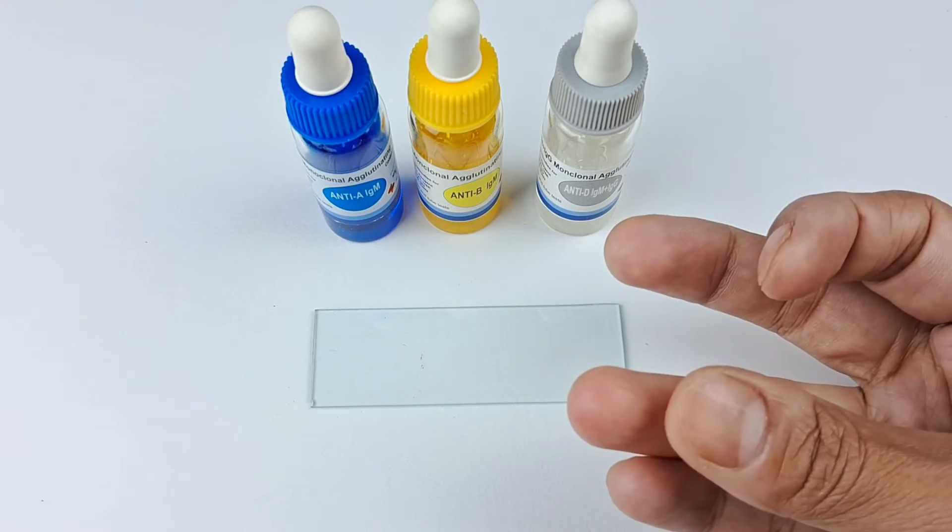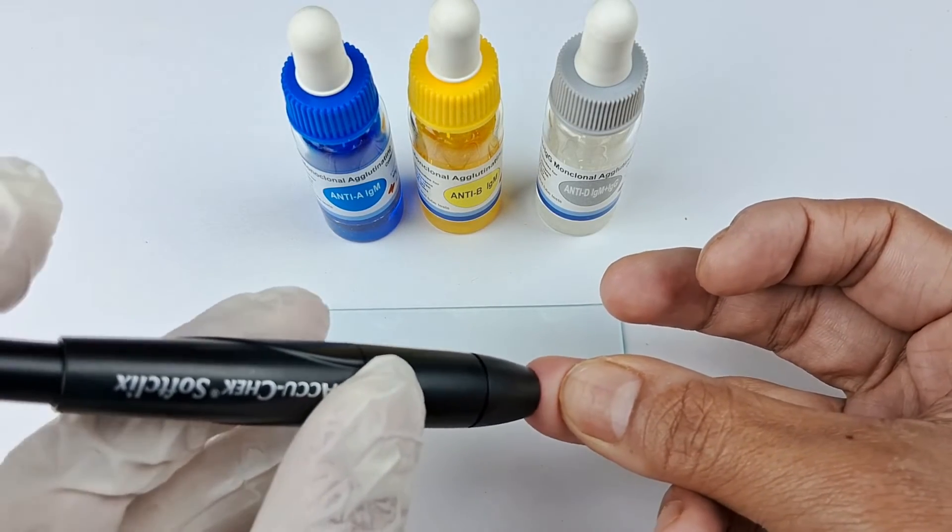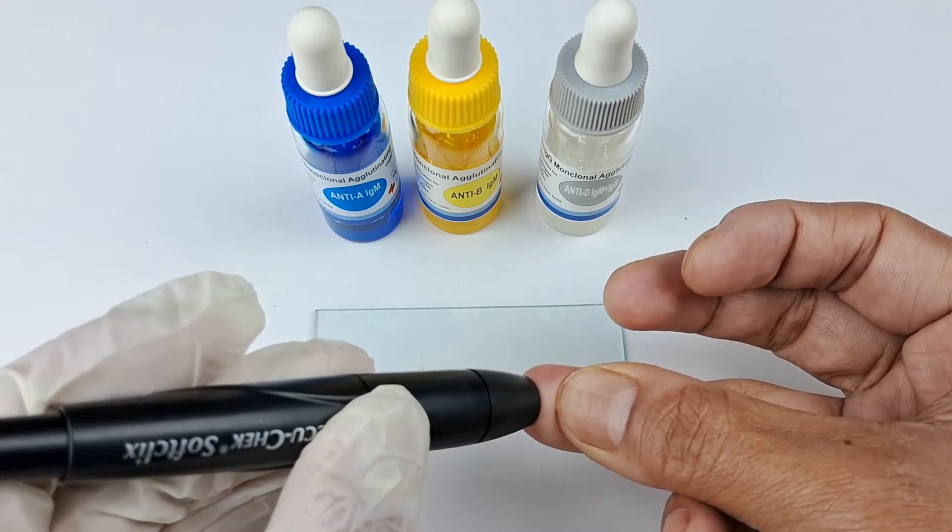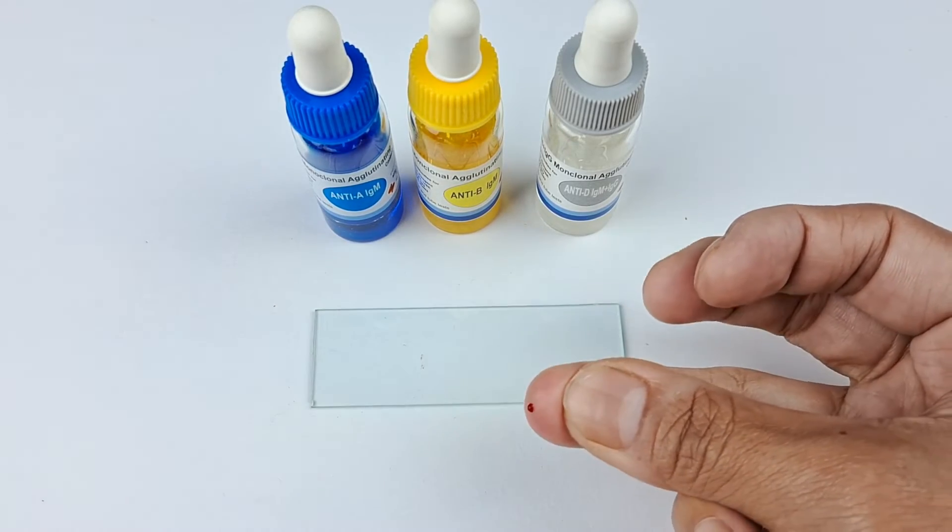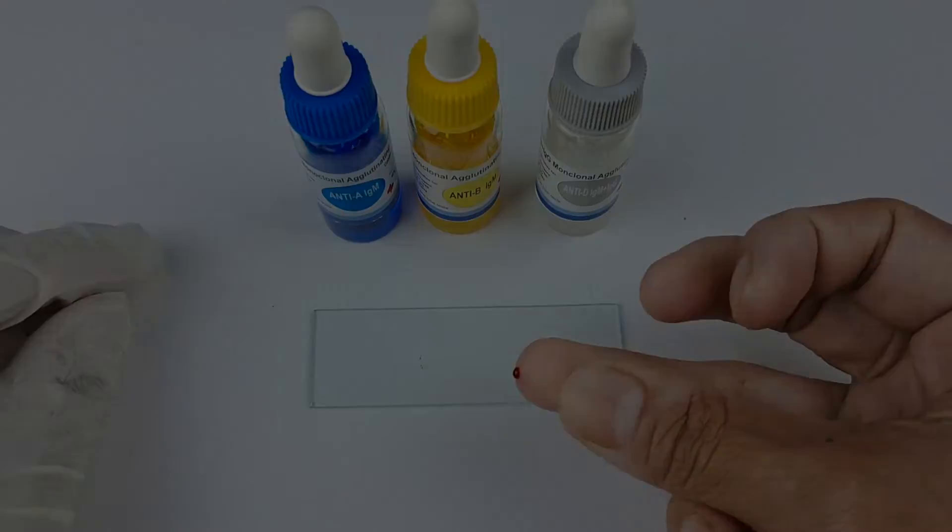Allow the alcohol to dry and then gently but briskly prick the finger using the lancet or the pricking pen. Always remember to use a new lancet or pricking needle for each person. You may or may not wipe off the first blood ooze.